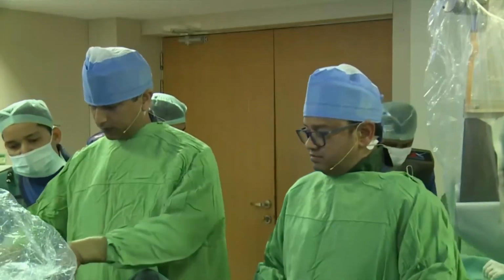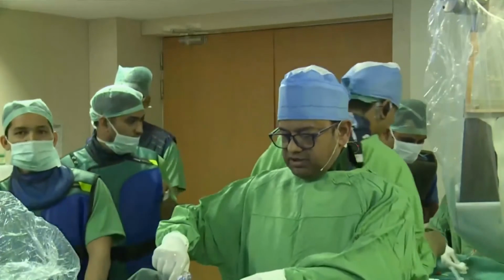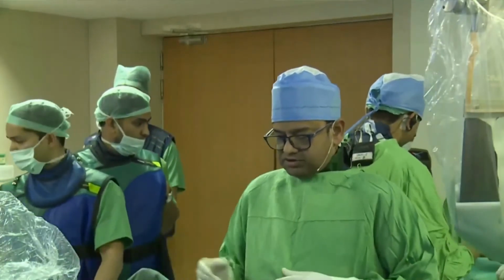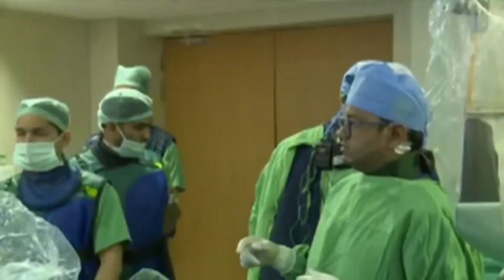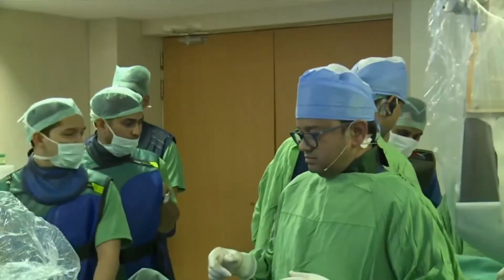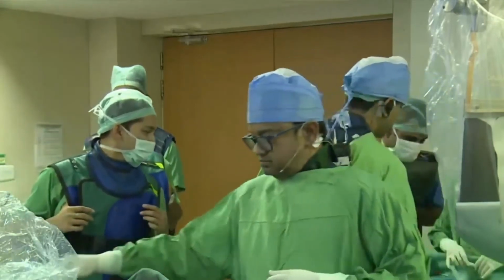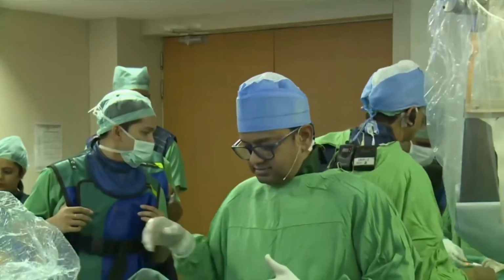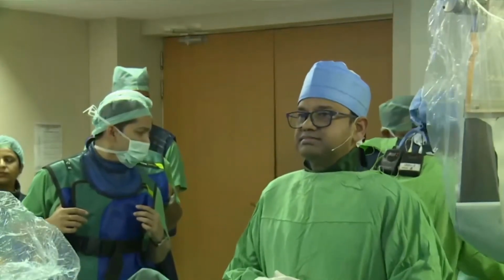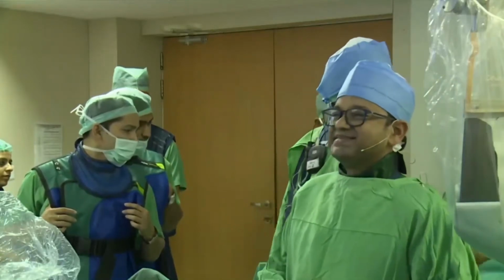Can we have the wire? Yes, sir. We'll have to recalibrate it. So we are planning to do an FFR post procedure because the OCT looks quite satisfactory. Can we equalize that with the FFR wire? It will take 2 to 3 minutes. That's very interesting, because according to Professor Nico Pijls, we should aim for a fractional flow reserve of 0.9 post-procedure. So good luck with that. 5 ml and drop here. Yes, let's try.